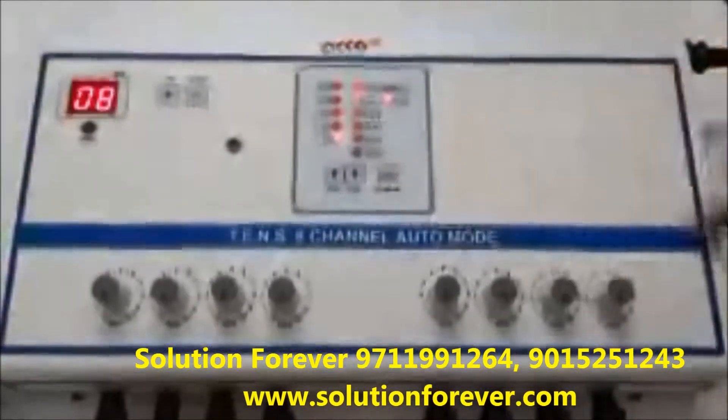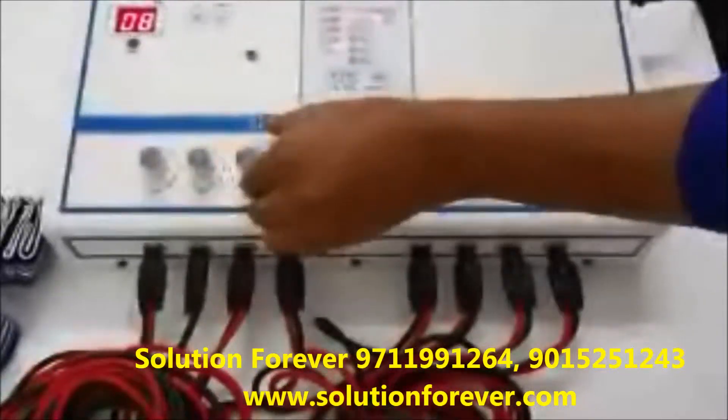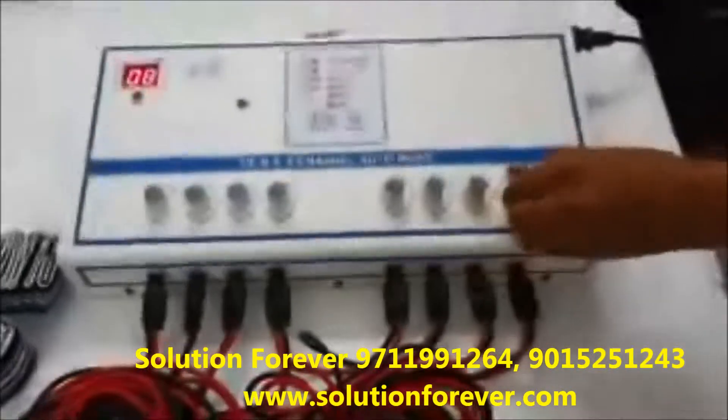Now press the start button. Increase the intensity as per your need: channel 1, 2, 3, 4, 5, 6, 7, 8.